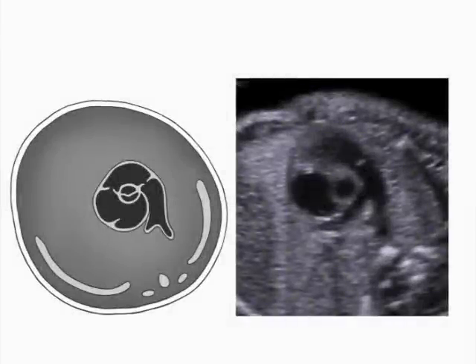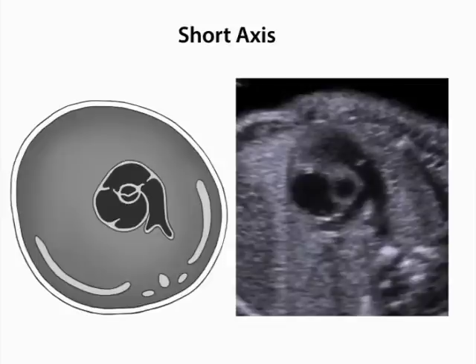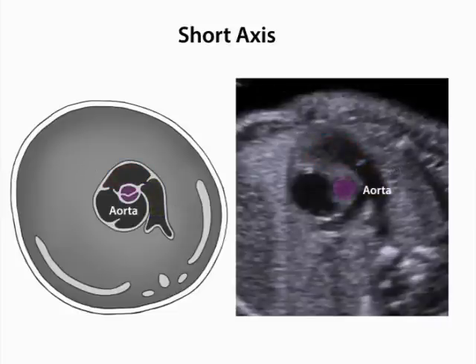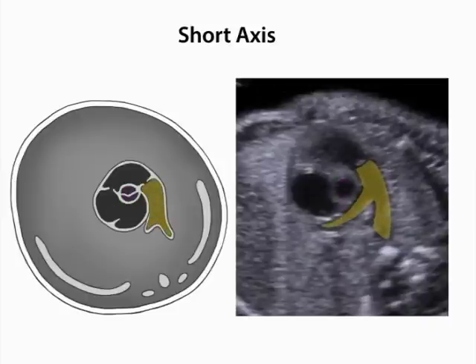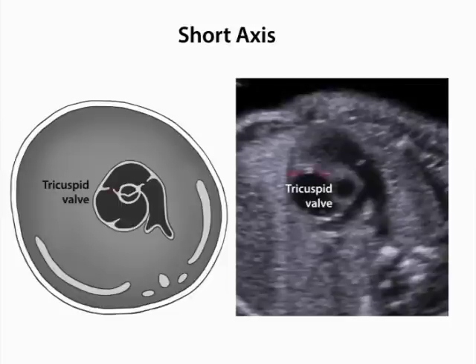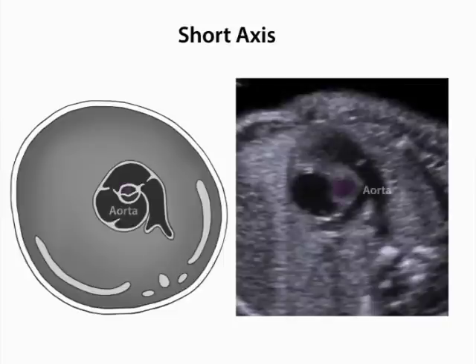Each of the structures seen in the right ventricular outflow track view is also visible in the short axis view of the great arteries, which is shown here. These views are equivalent, although obtained at slightly different orientations. In the short axis view, the right atrium, right ventricle, and main pulmonary artery are visible encircling the aortic root. The main pulmonary artery branches into the right and left pulmonary arteries. The tricuspid valve and pulmonic valve are also visible in this image. Note that the aortic root and pulmonary artery are similar in size.